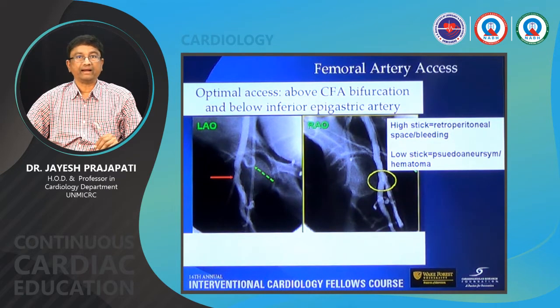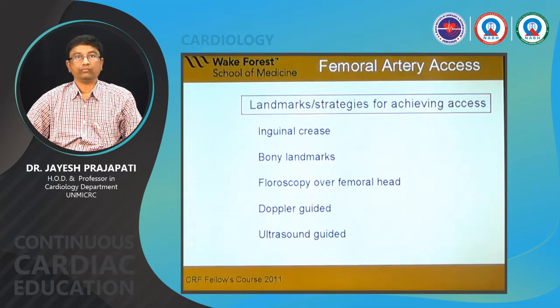This is the common thing that we are doing. But if you want to take a large bore access, where the chances of complication are high, like TAVI or TEVAR, where you go with more than 14 French puncture, we always have to go ultrasound guided. People do an ultrasound and then puncture the femoral artery. Sometimes you are not able to puncture blindly, and then it is always better to do an ultrasound guided puncture. That is also one thing.